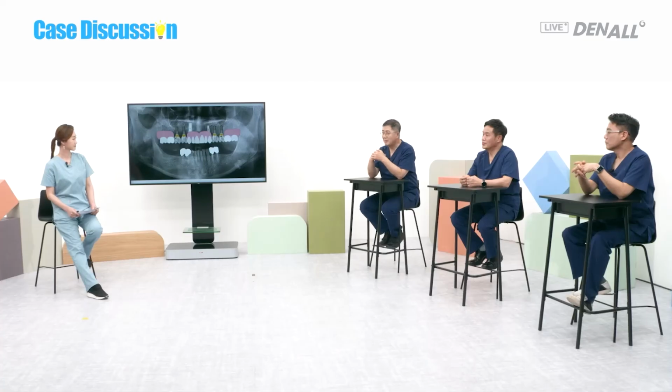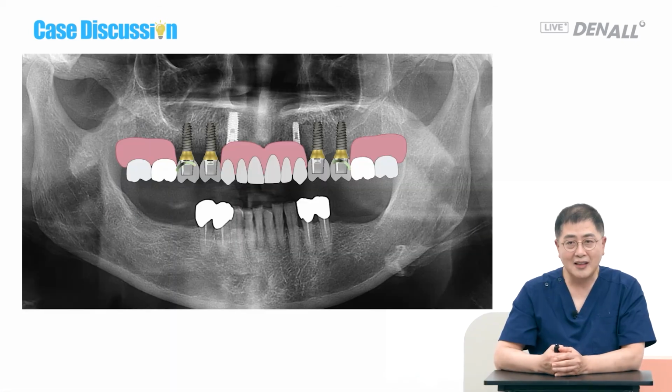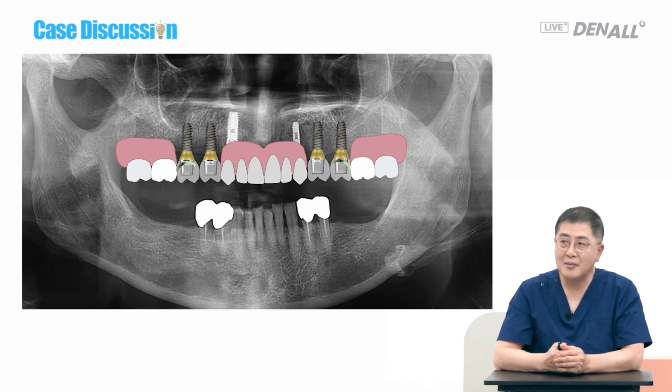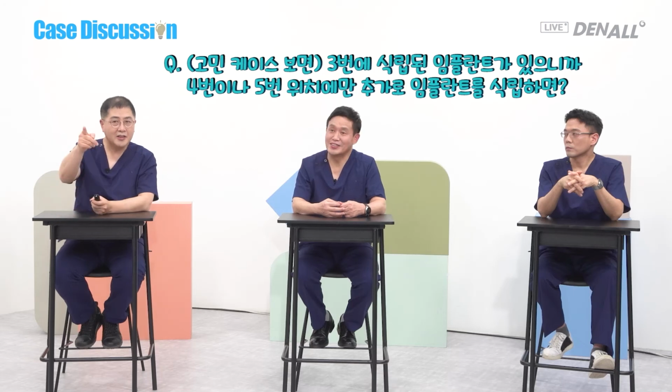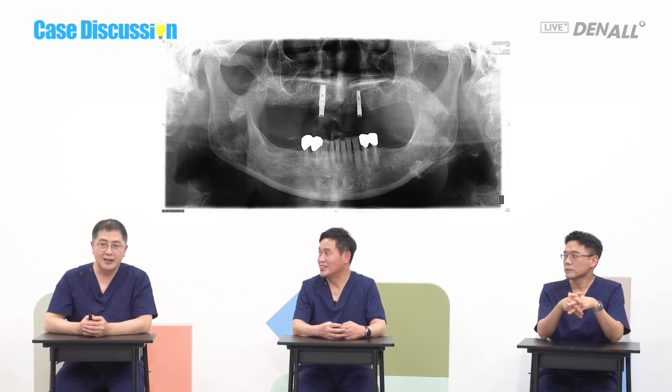Yes. Not many doctors have tried this. Many people are worried that it may give too much burden on the implants. I think this is excellent because I have used it in more than 50 cases. I strongly recommend that. You already have 3 and 3 implants, so you place 4, 4, or 5, 5. Looking at the case under discussion, number 13 and 23, I don't think the directions are good.